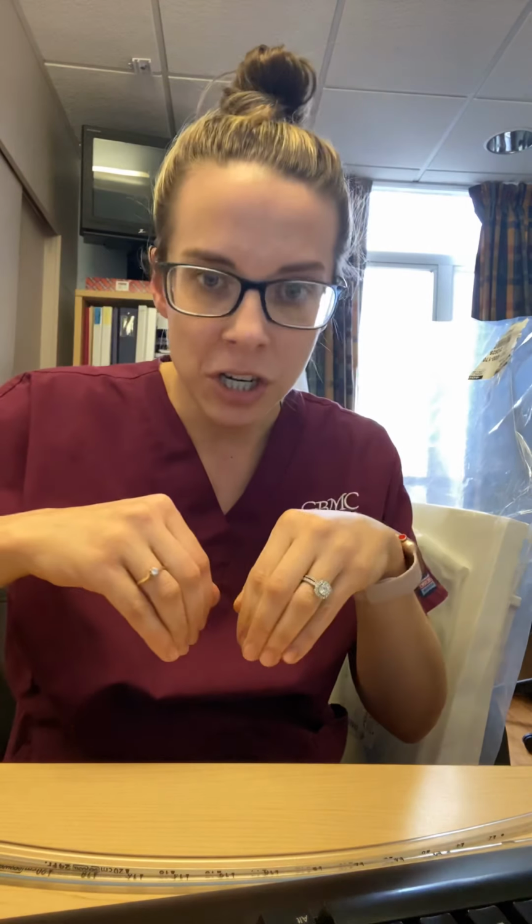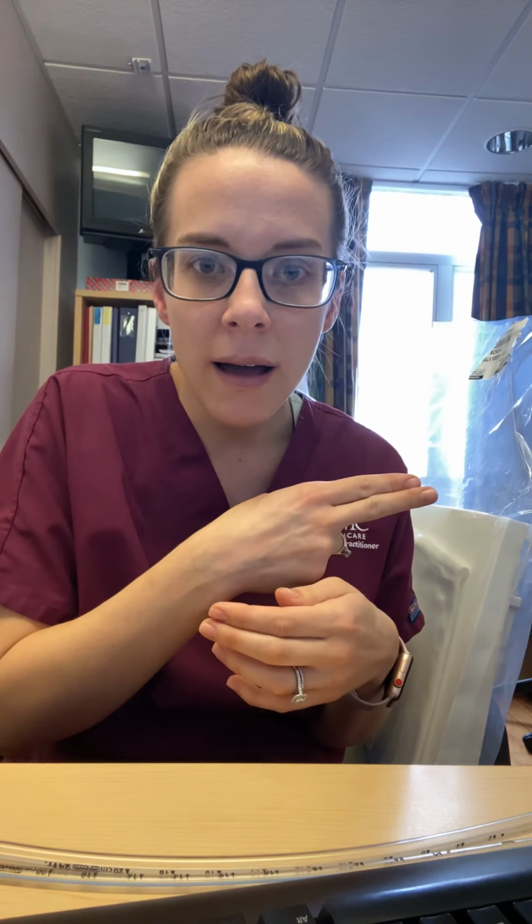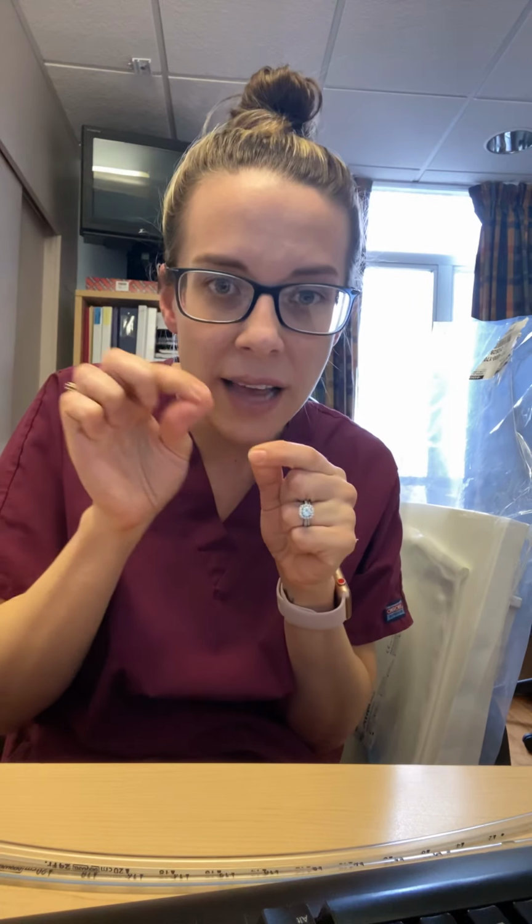The first thing that's going to happen is if they're draining any fluid or blood, that fluid is going to go in the collection chamber, a separate chamber. If they have an air leak, which basically means there's some disruption in the lung parenchyma most commonly. So if they did a lobectomy, they stapled a piece of the lung off and sent it off to pathology, well, you know, you have a big balloon of all these air sacs. When they staple across, sometimes those little air sacs can leak air into the pleural cavity.